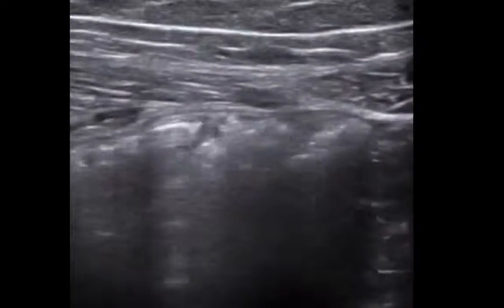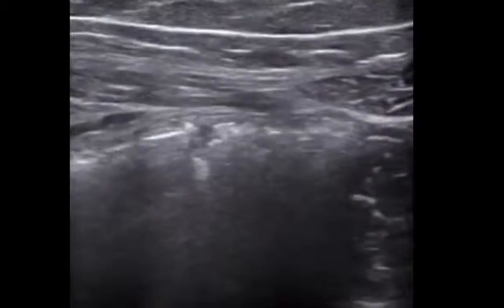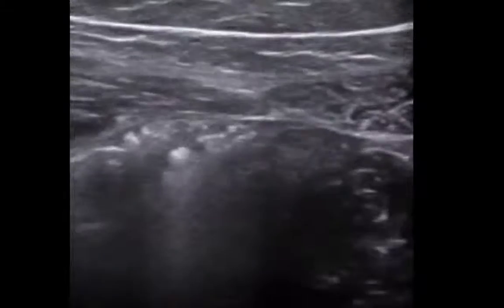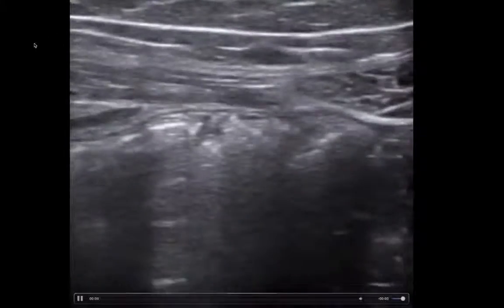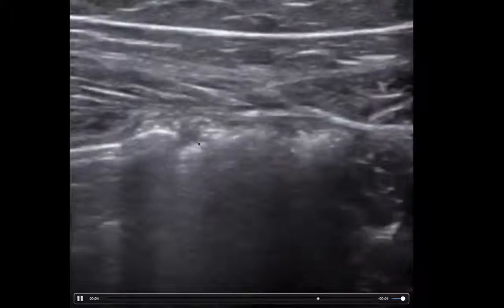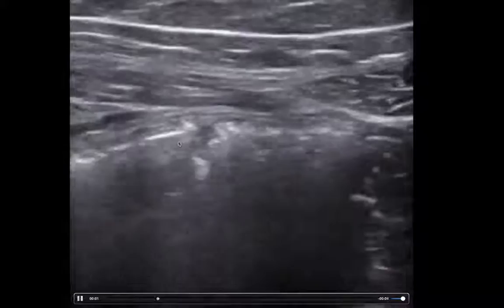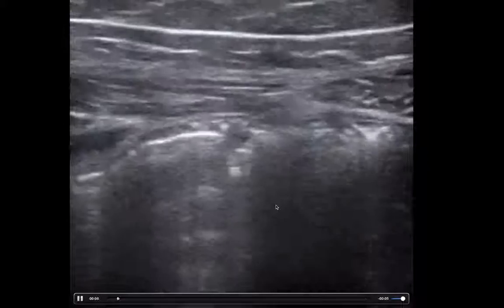You'll want to find the transition between the cecum and the ileum. The appendix is, of course, going to be a blind-ended pouch coming off of the cecum. The cecum, which is the large intestine, is going to show a gas pattern that typically is lumpy, bumpy like we see here. So instead of there being a nice straight line with A lines below it, kind of like how you see in a lung, you see this irregular line with some dirty shadowing underneath. This is thought to be what the large bowel looks like.